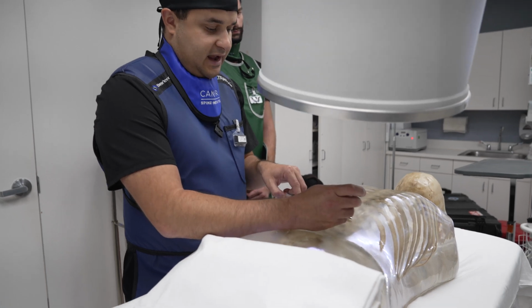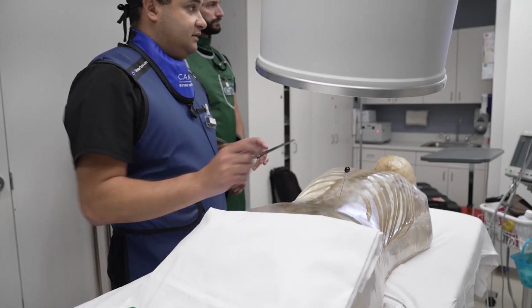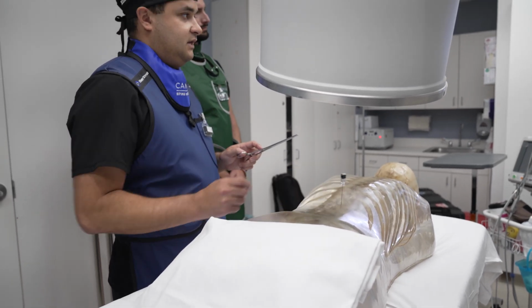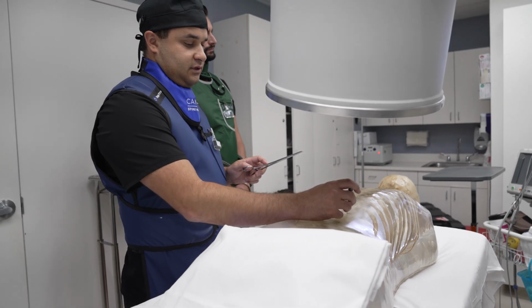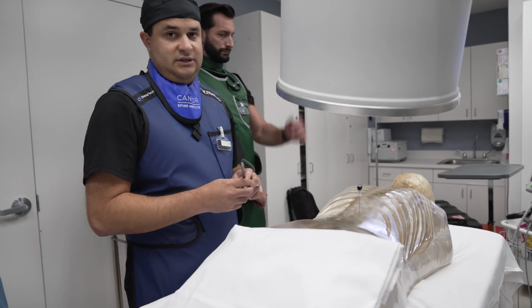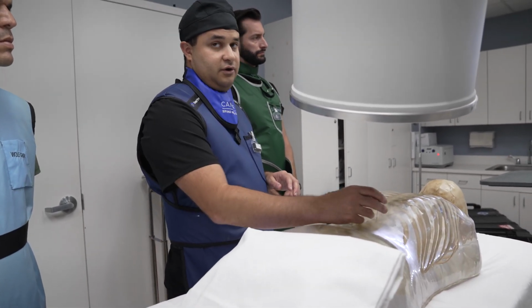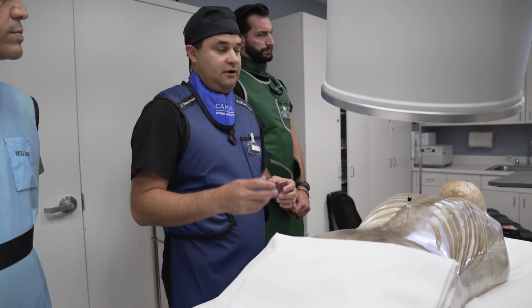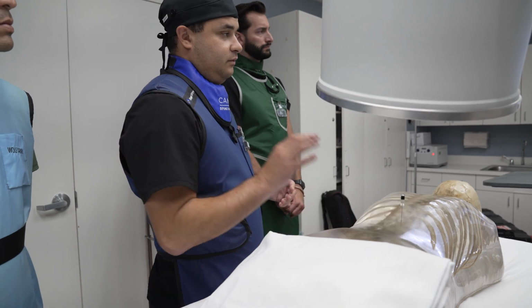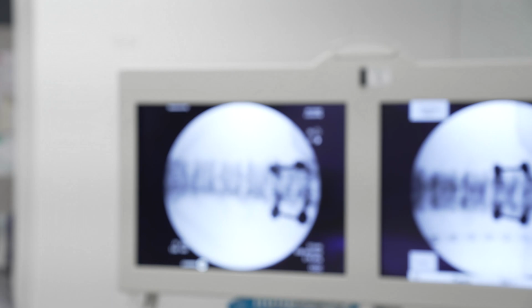So why would someone have a transforaminal injection? The main reason is usually a radiculopathy or radiculitis, where the patient has sciatic pain, as everyone knows it, shooting down their leg, and the main cause of that is usually disc herniation. Depending on age, it's usually disc herniation, or foraminal stenosis due to other reasons of the spine, such as facet overgrowth or ligament overgrowth. So, let's take a shot. We're right under that eye of the Scotty dog. Remember that pedicle there? That's right where we want to be.